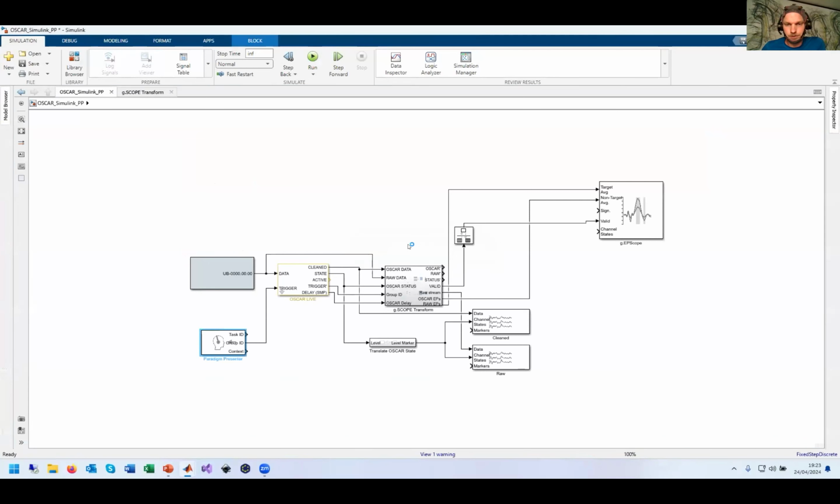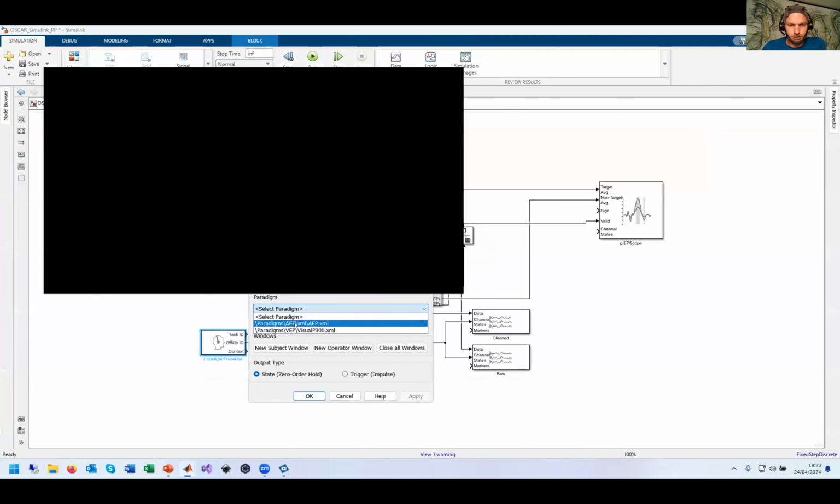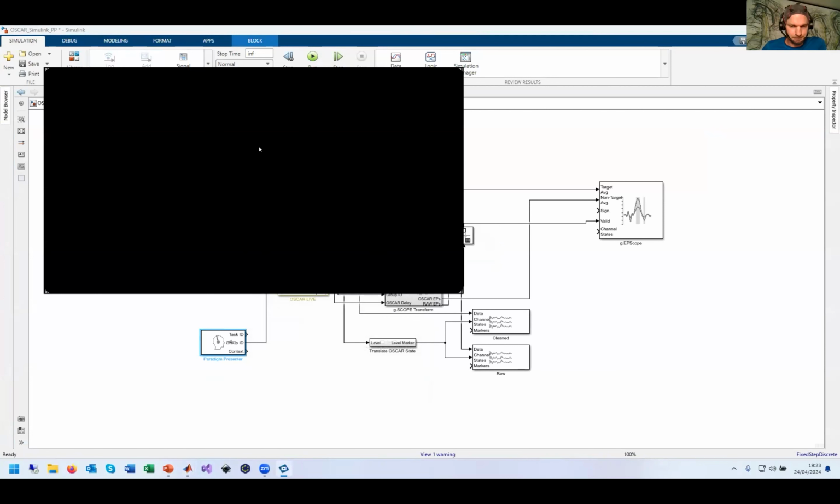So this paradigm consists of a series of images that are shown to me randomly. All of them are grayscale, but one of them is in color. And usually this is the purpose or the principle of an oddball paradigm. When a stimulus that deviates from the other stimuli occurs in a pool of those stimuli, and you're focusing on this stimulus and you may be counting it, then you react, your brain waves show that as a P300 wave.